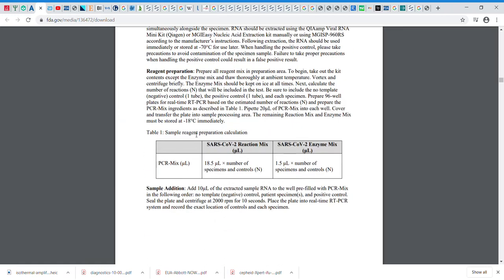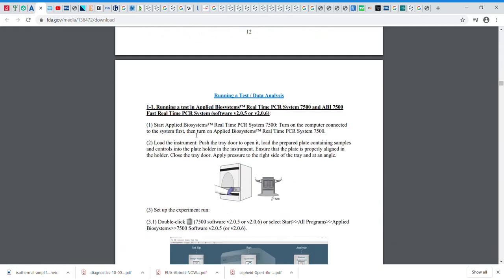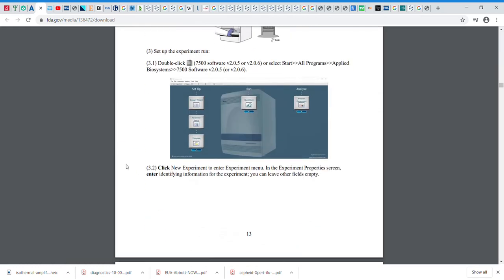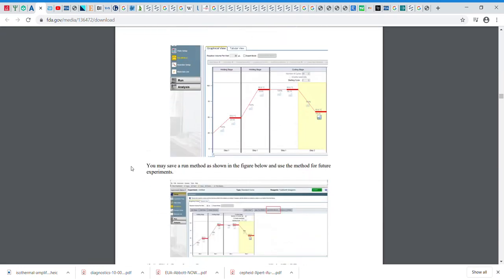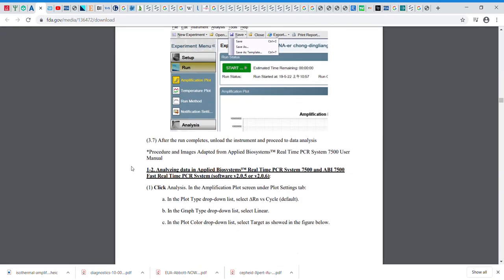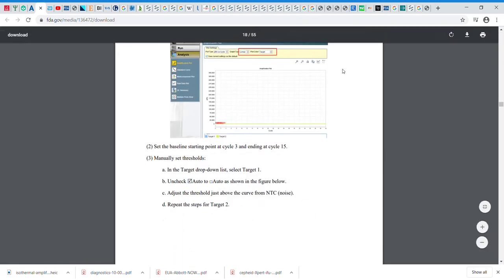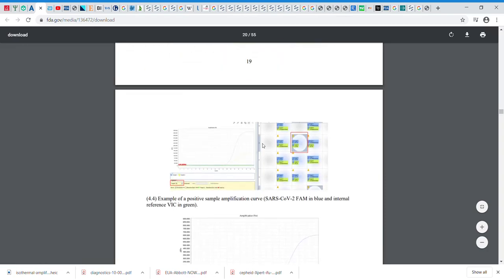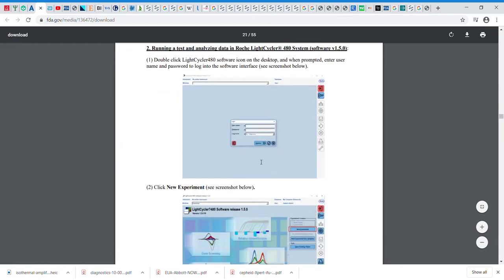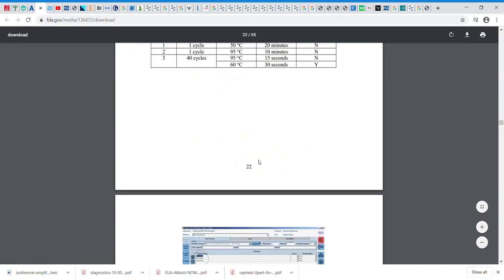So the idea is that you could have the DNA or RNA inside, but you need to extract it. Get it out so you can work with it. They tell you how to sort of run the system. You have different graphs here. A different system.